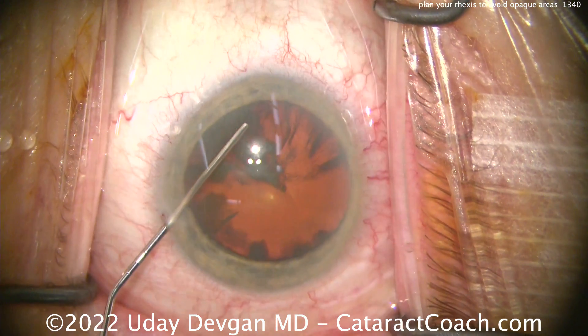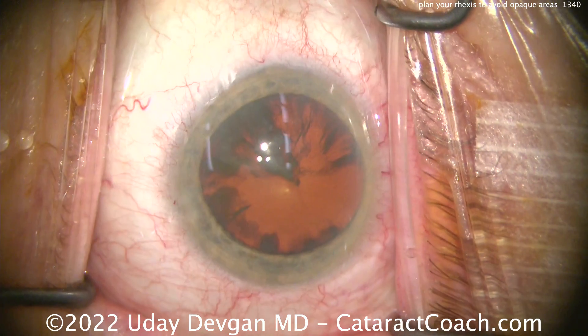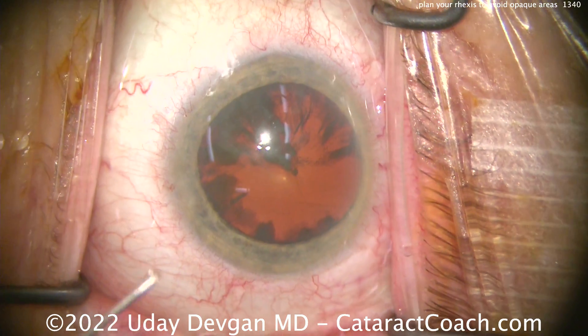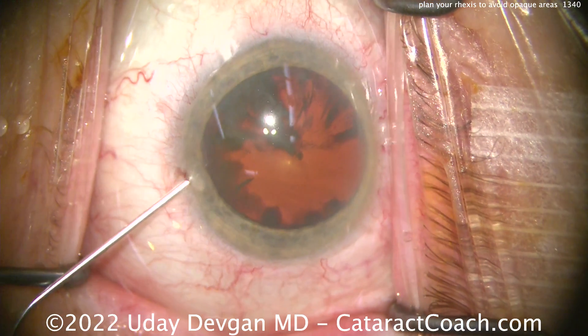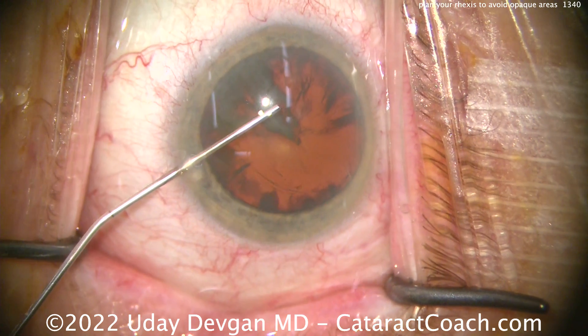Here's our cataract case. You can see a lot of cortical opacities. We can try and milk some of them forwards, as shown in the last video, but in this case they're quite extensive opacities and they're certainly going to be in the path of our intended 5 to 5.5 mm capsulorrhexis.